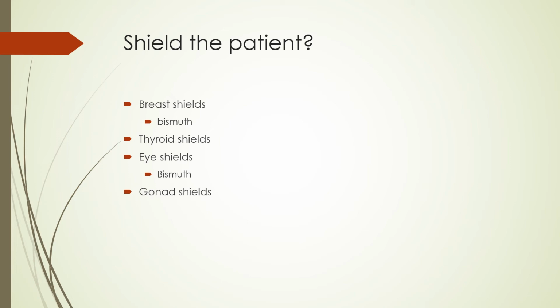These include wasted radiation, reduced image quality, and unpredictable results when combined with automatic exposure control, tube current modulation, or dual energy acquisitions. Alternative techniques exist that can provide equivalent anterior dose reduction at the same or superior image quality without the limitations of bismuth shields. The AAPM recommends that these alternatives to bismuth shielding be carefully considered and implemented when possible.